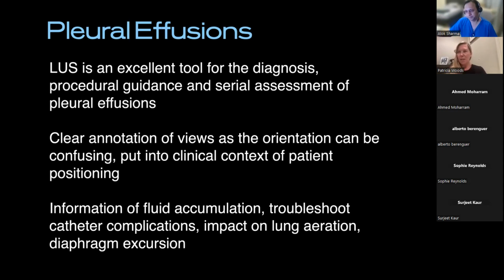But I think for me, when I'm just starting images, I would usually start in a least dependent lung area, so centrally and coming laterally. And I think you just get a feeling then of if the fluid's creeping up and now surrounding you. The first image I showed you with the baby prone, there was already a centimeter covering the entire least dependent part. You've got to have significant fluid if it's come right the way around the top and you've been there for some time. So do I have a position? Not always. I just try and make it relevant to the baby.